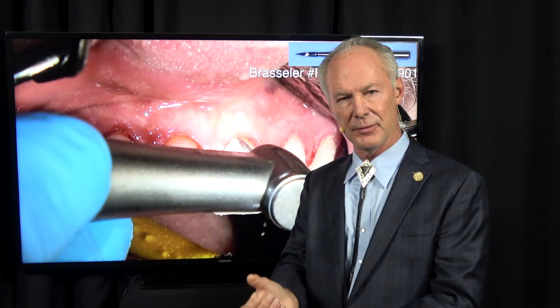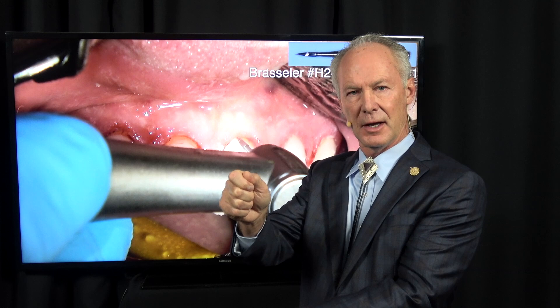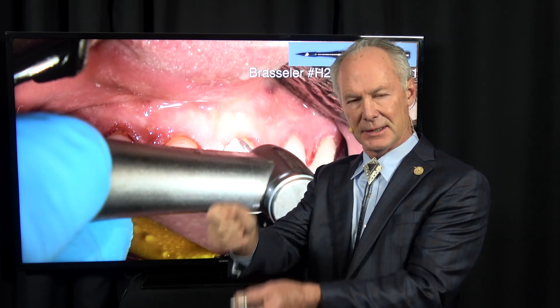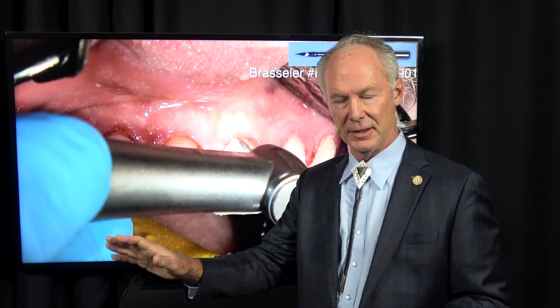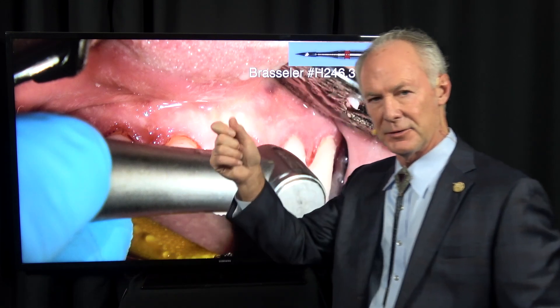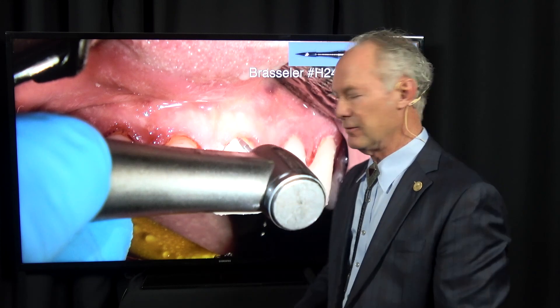What I do is place one curing light on the facial and one on the palatal, and cure them 60 seconds per tooth. That's probably significant overcure, but you can't overcure a composite — you can undercure. I want to be sure they're completely cured. I go 60 seconds on each side with each veneer.